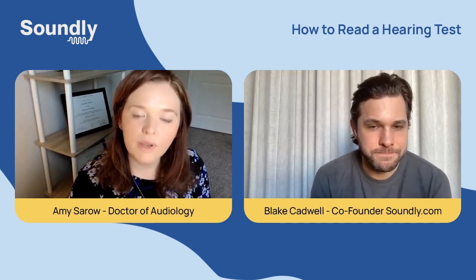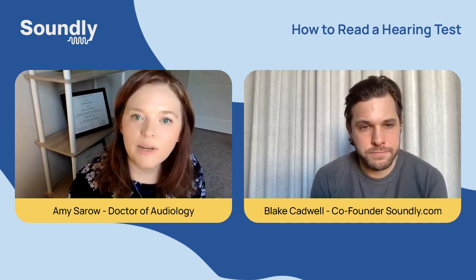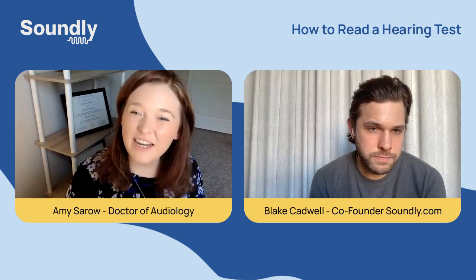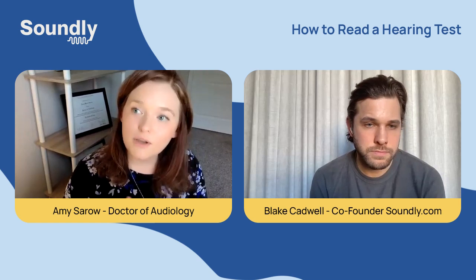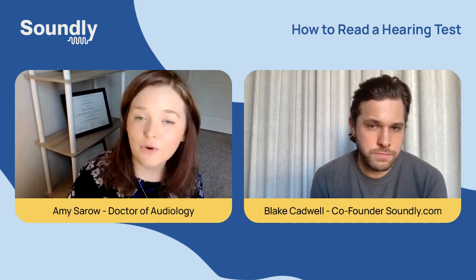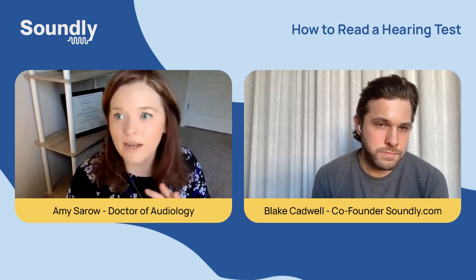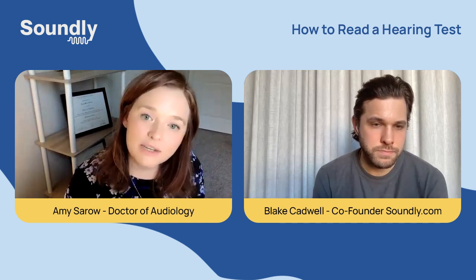Looking at the hearing test, the professional can go over that with you and explain what that means in your situation, in terms of counseling, in terms of potentially validating some of your concerns and saying, oh, you're having difficulty in background noise. Well, let's talk about why. And we can also talk about recommendations for your specific situation. So if you have good low frequency hearing, we would make one recommendation versus somebody who has, let's say, a flat moderate or a flat severe loss. That's going to be a different recommendation.